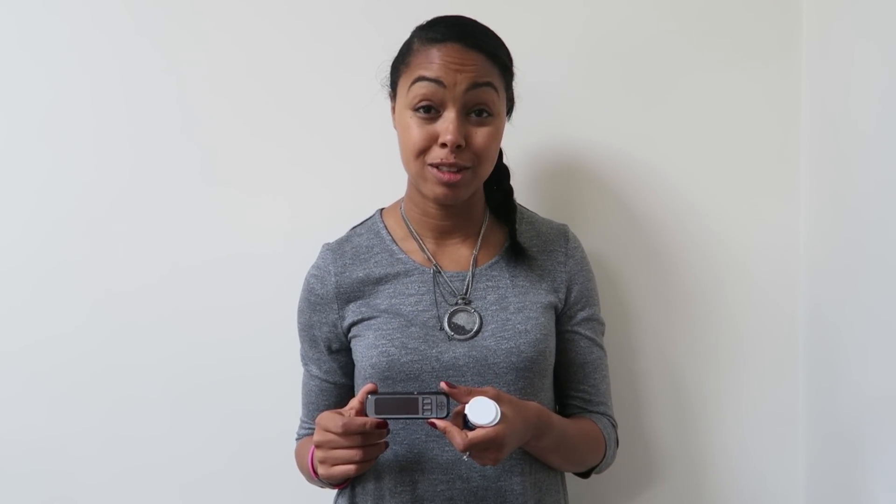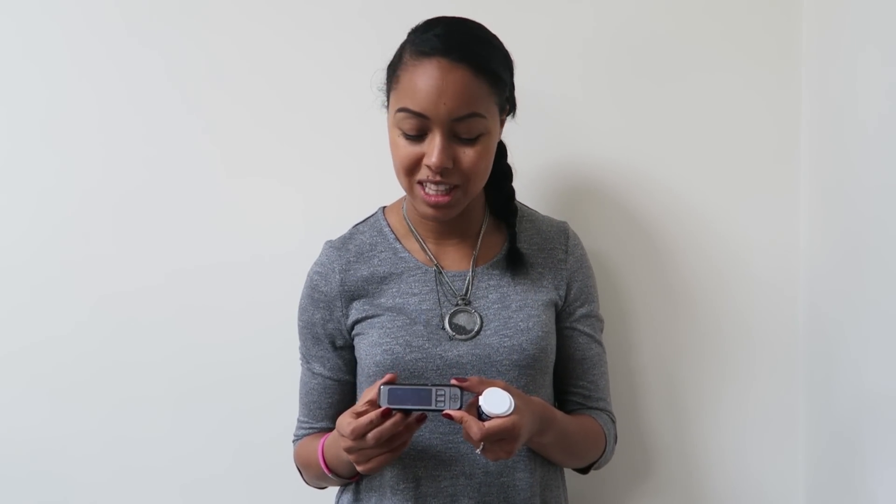Today I'd like to talk about the Contour Next Link blood glucose measuring device, which is the one that's paired with the Medtronic MiniMed 640G insulin pump. The blood glucose monitor has got some really clever features about it, so I thought it was worth discussing.